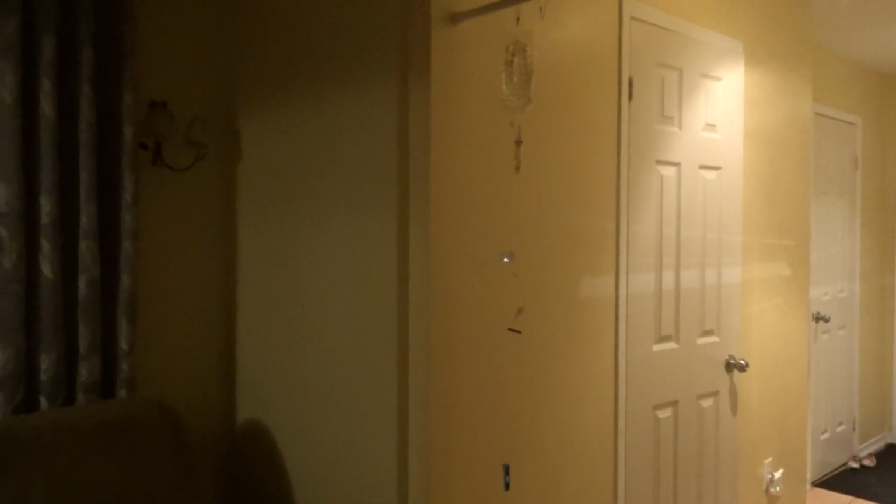Hope you can see here that I have. And then the first thing I'm gonna do is lock the main line. So I'm just gonna lock it. So it's locked. I'm just gonna put this hook right here for now.